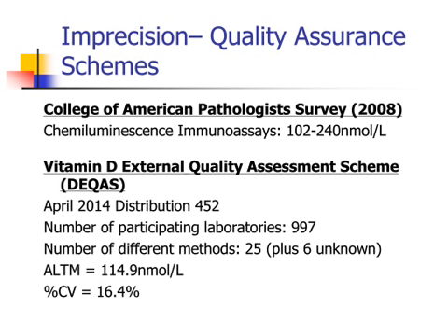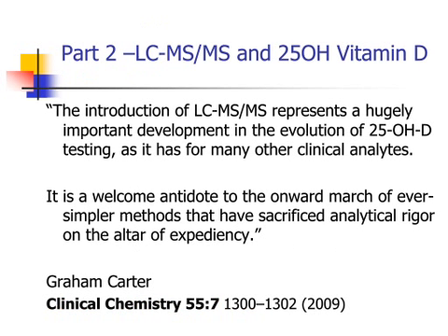But what's still worrying is the range of results that you could get from these different labs. Because for that same sample, some labs were reporting 39 nanomoles per liter and some were reporting 176. So there's still quite an issue here with measuring this metabolite properly. And that's where HPLC with tandem mass spectrometry really comes into it.